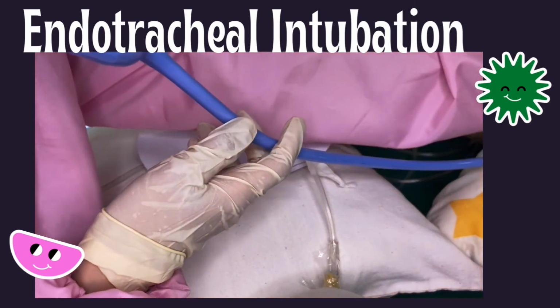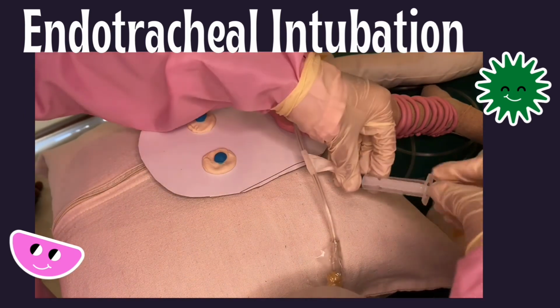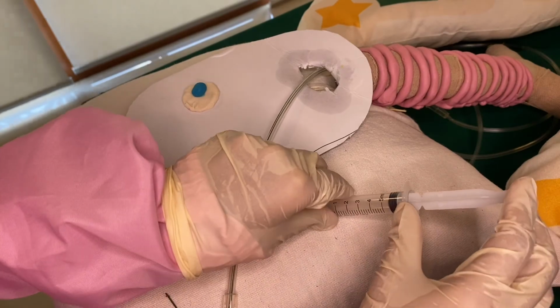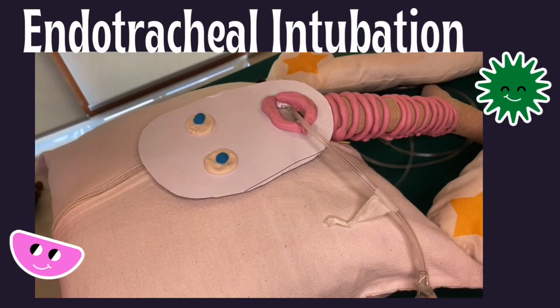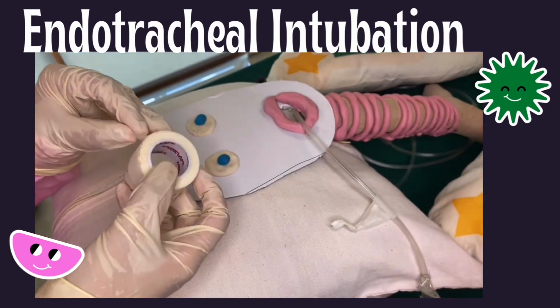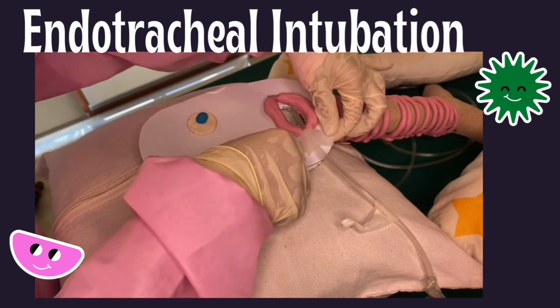If the right lung was noted to be louder, the endotracheal tube might be lodged at the right bronchus. Deflate the balloon completely and pull the tube 1 cm at a time. Inflate the balloon again and auscultate for equal breath sounds. Once it's done, secure the tube with plaster and insert an oropharyngeal airway to avoid biting and for easy suctioning of the secretions.